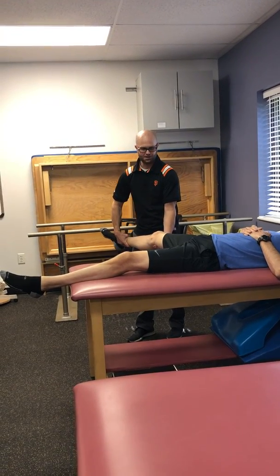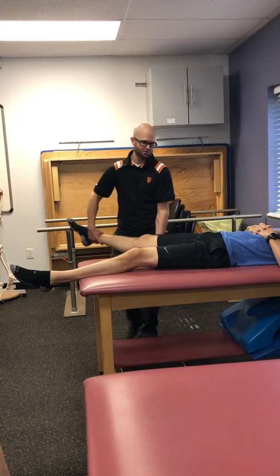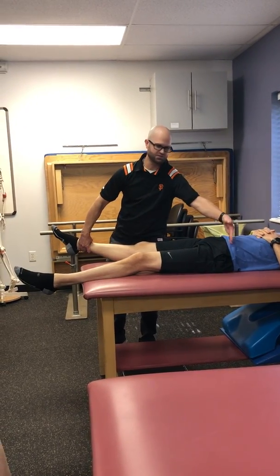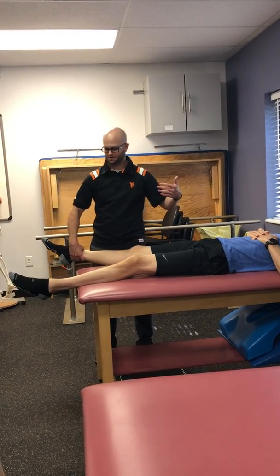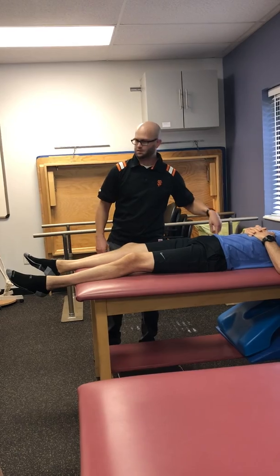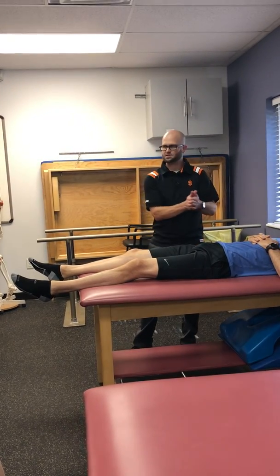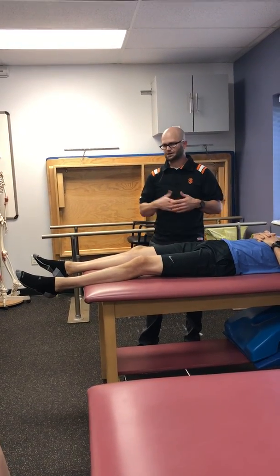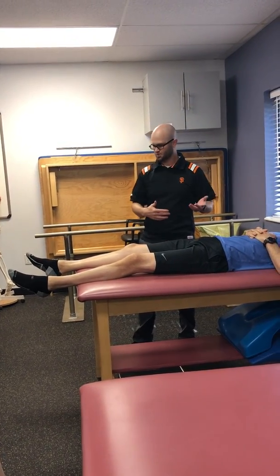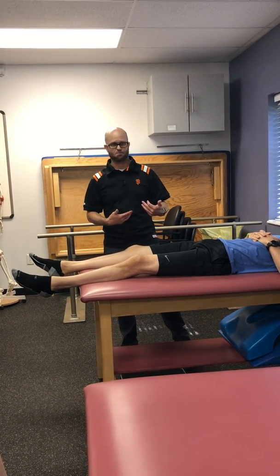Now, I know I can stop because number one, I'm getting that end feel. Number two, I can see his pelvis start to move. Now, that movement of the pelvis doesn't matter a ton when we're measuring this, because our alignment points actually move right along with the motion itself. So it's not going to change how big or how small, but it tells us where end range is.